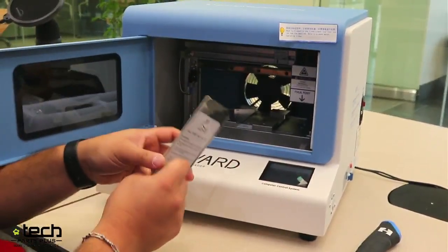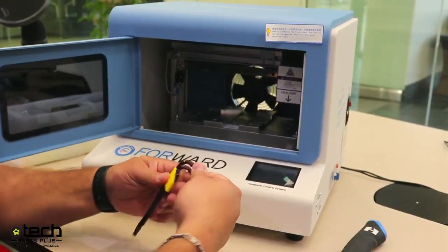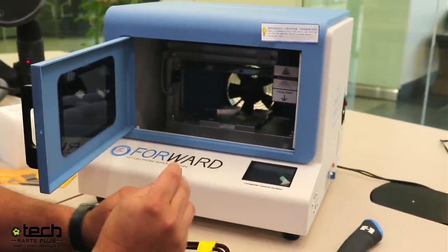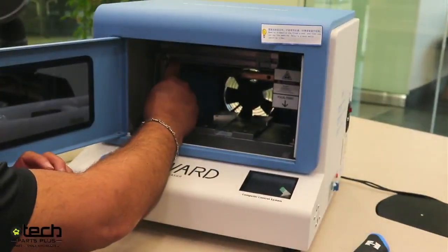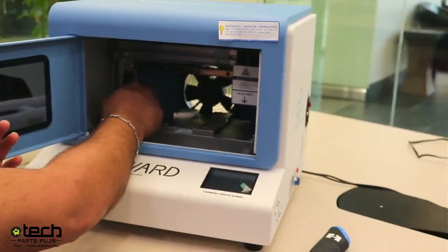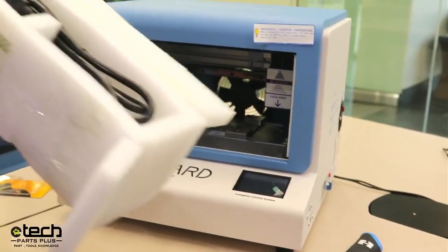Take your Allen wrench set — I believe it's the third from the largest. Get in there and loosen it. Anything you're taking off, I would just put into the cube to hold on to. Even better if you have a little plastic Ziploc bag to keep it all together, because if you have to ship the machine out for some reason and this platform is just loose inside the machine, you run risks.